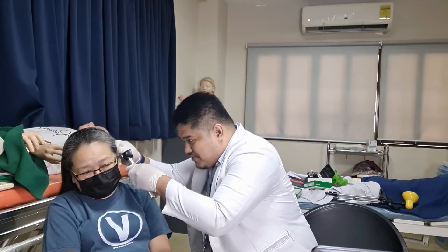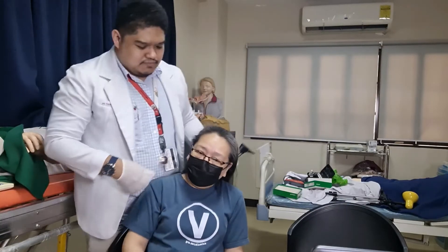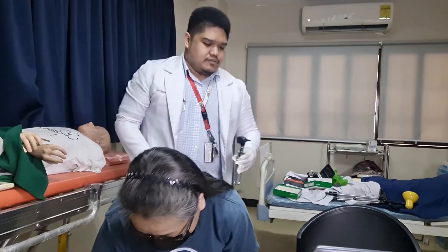I am now inspecting and there is some presence of cerumen from the patient. The ear canal has cerumen, and you also have to inspect the tympanic membrane. At this point, the tympanic membrane of the patient is intact and pearly gray in appearance. We will do the same on the other side. The patient's ear canal and ear drum are intact, with presence of cerumen on both the left and right sides.